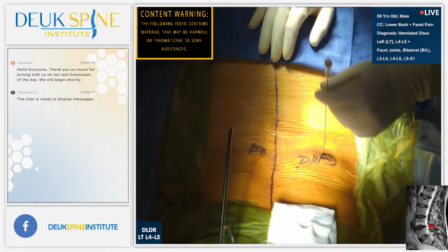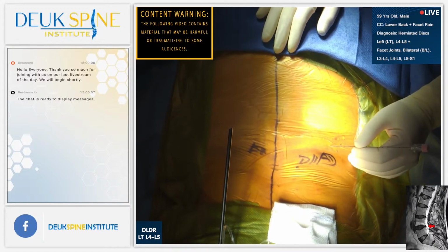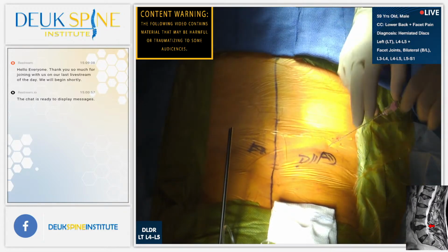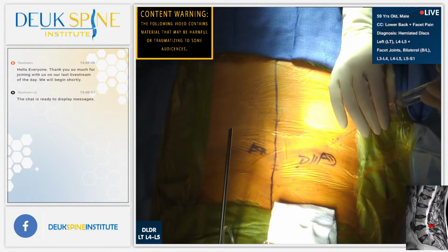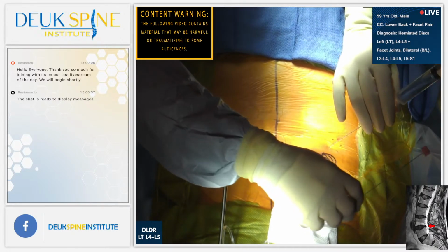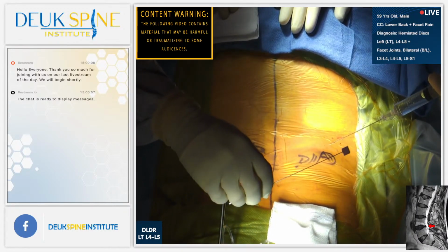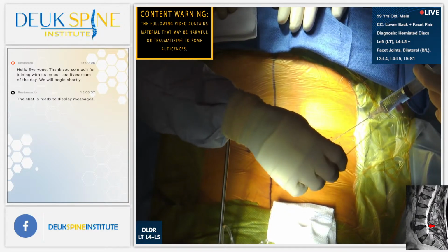I'm Dr. Deuk Majan. I'm here with my team at Deuk Spine. And our patient is here from Texas. He is here because he has back pain. He has been suffering with back pain for many years. In particular, he has a disc herniation or annular tear at L4-5. We're going to give him some numbing medicine shot. Okay, looking good. Shot.